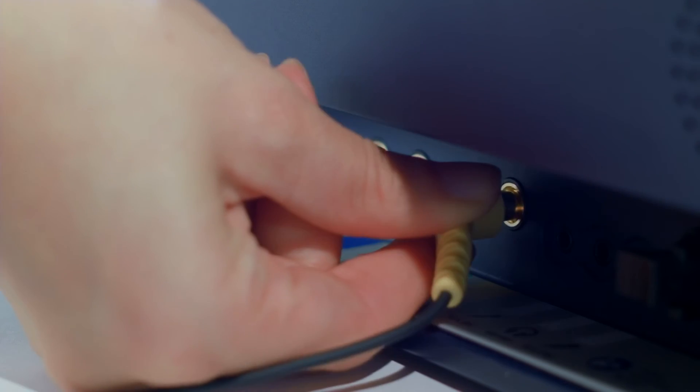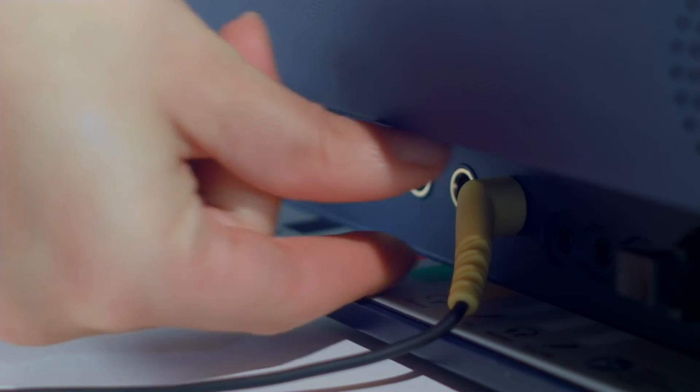Connect the contralateral phone to the yellow jack labeled Contra. Place the contralateral phone carefully on the opposite ear of where the probe is placed on the patient.